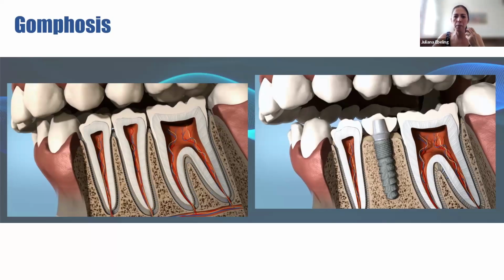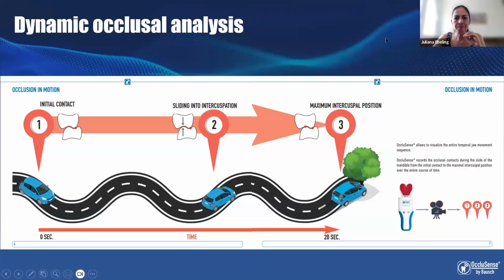This is really, really important, and OccluSense makes a great difference for this. Okay until now? Okay, yes.